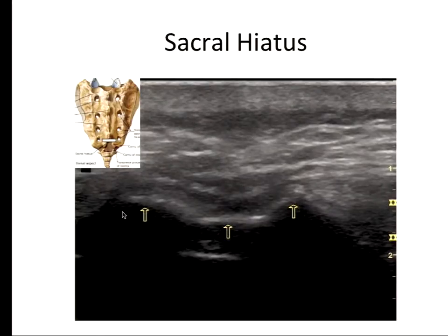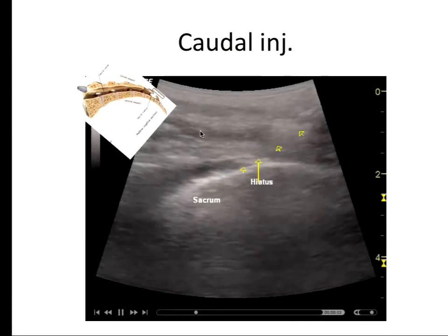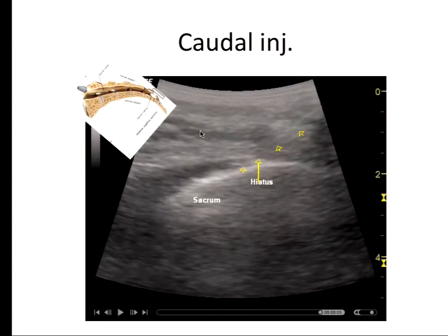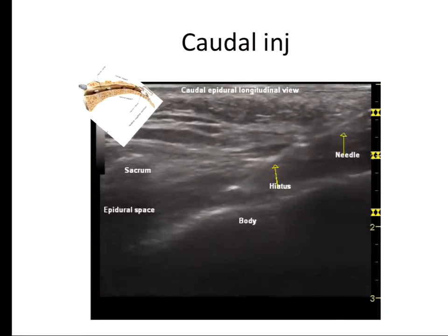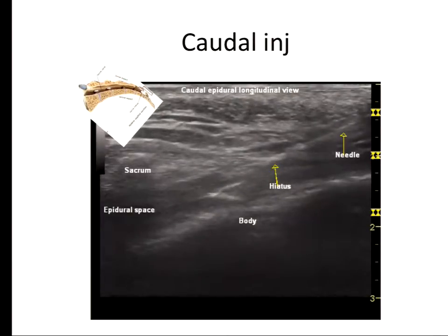The typical appearance is almost like a bunny with two ears, and then you have the sacrococcygeal ligament in between — this is the posterior part of the sacrum. In real time, I would place a needle in-plane, coming straight down through the sacrococcygeal membrane to target the epidural space. You are able to see the needle to a certain extent, but beyond that you won't be able to see it — bone prevents you from visualizing the entire needle, which is one limitation.